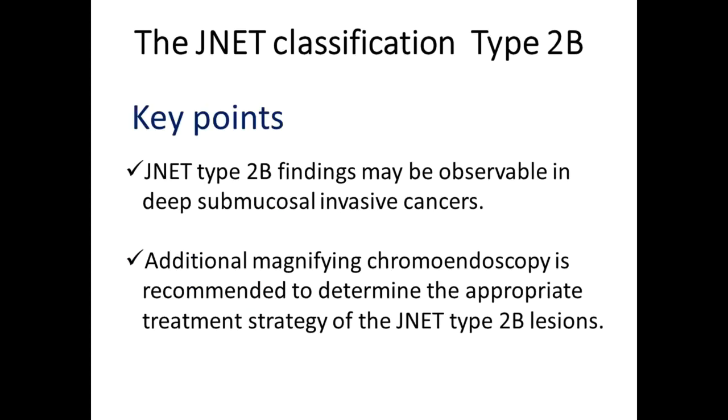JNET type 2B findings may be observable in deep submucosal invasive cancers. Additional magnifying chromoendoscopy is recommended to determine the appropriate treatment strategy of JNET type 2B lesions.